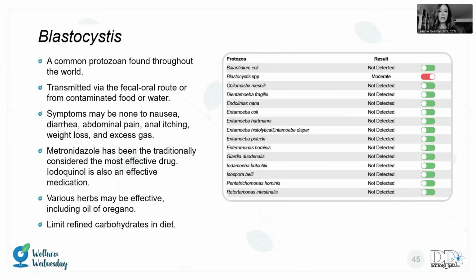But at some point, when it starts to elevate and cause symptoms, and that we'll talk about later, such as, well, it's here, gas, weight loss, diarrhea, abdominal pain, anal itching, if those are present, the recommendation from the literature is to treat. If no symptoms, the literature does not support treatment, just FYI. It might be an indicator that we need to rebuild the microbiome to sort of crowd this back down, but in terms of direct treatment, it is not recommended in the literature.